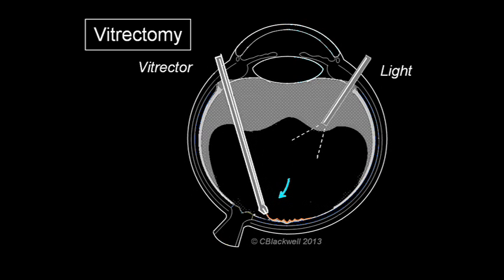With special, very fine forceps, one can delicately grab the edge of the membrane, peel it off the retina, and remove it from the eye.